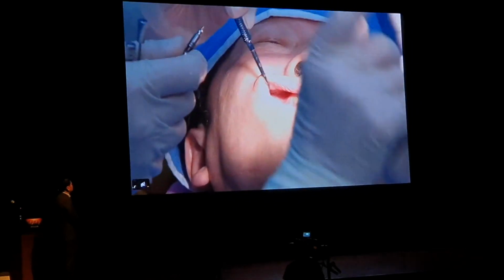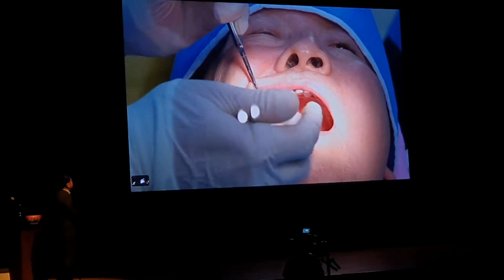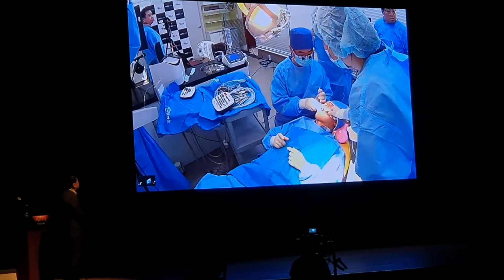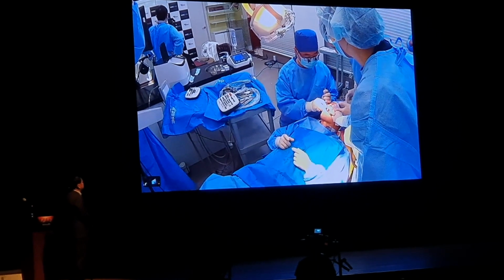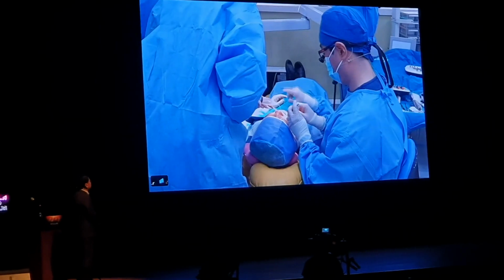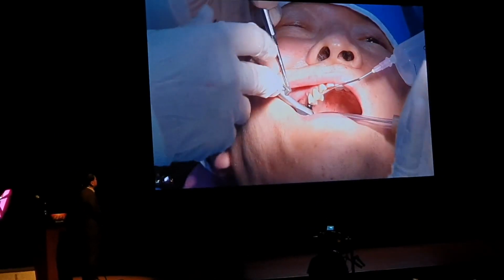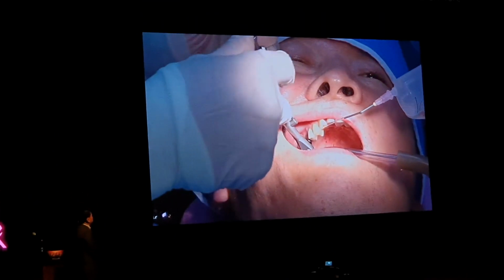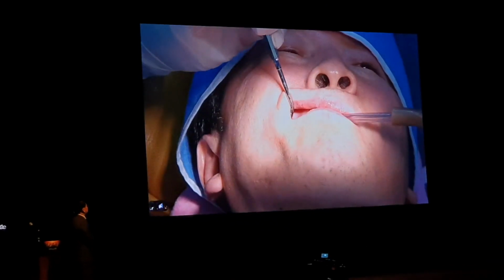Very ideal initial stability value, isn't it? So should I reverse it a bit? I will reverse the torque and set it to about 30 to 40 Newton centimeter. Alright, I'm reversing to finalize it to 40 Newton centimeter.